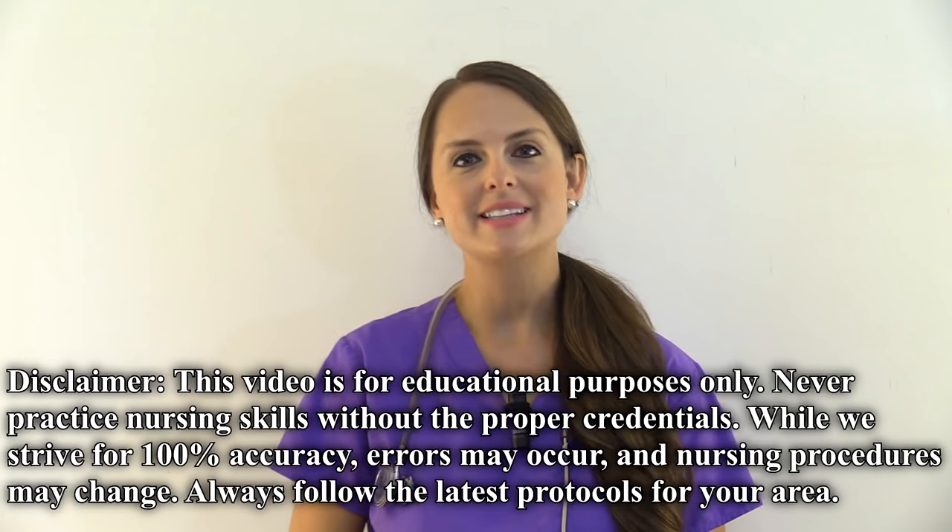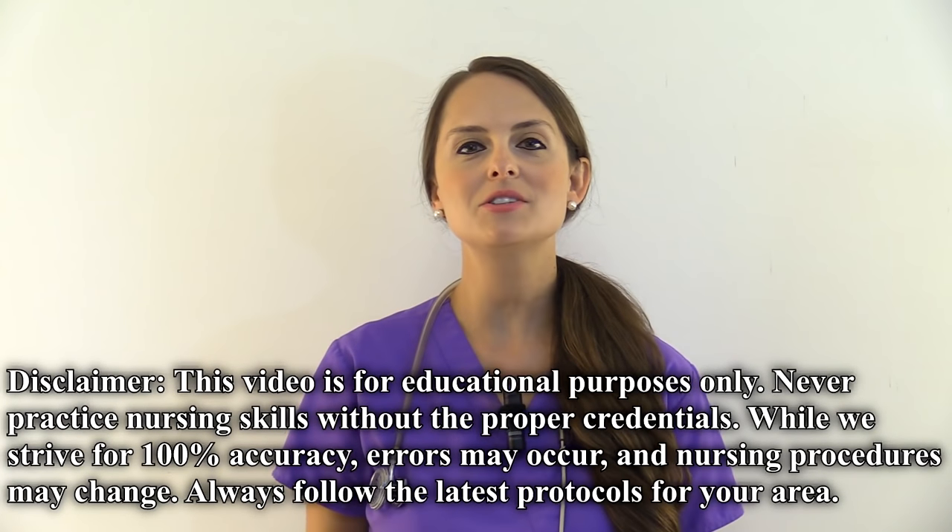Hey everyone, it's Sarah with RegisterNurseRN.com and in this video I want to demonstrate for you the lead placement for a 12-lead EKG.